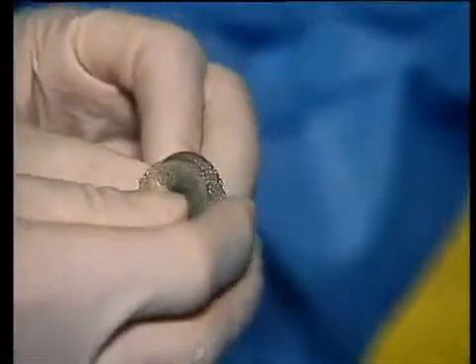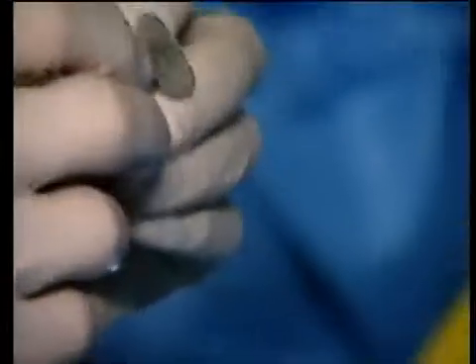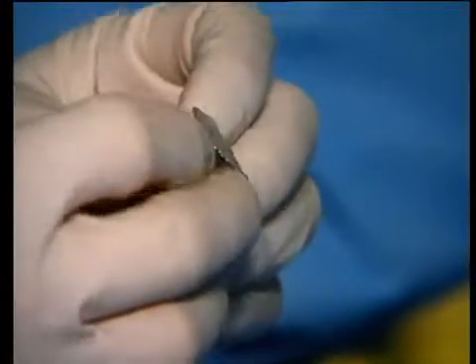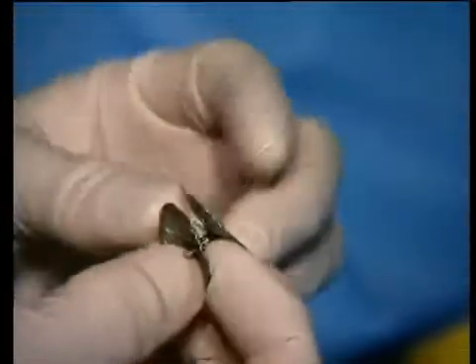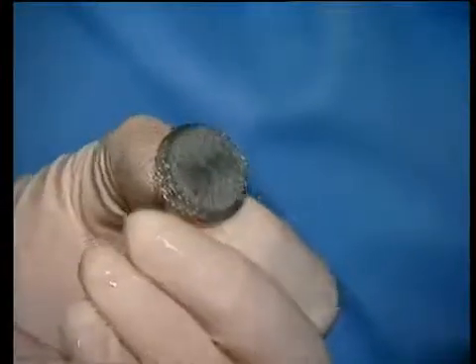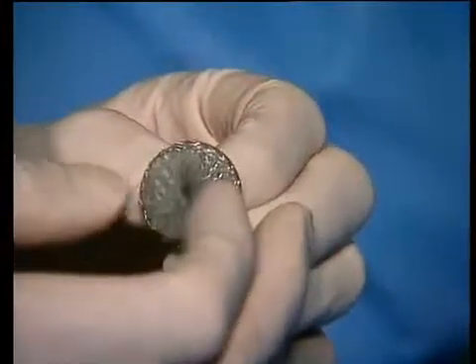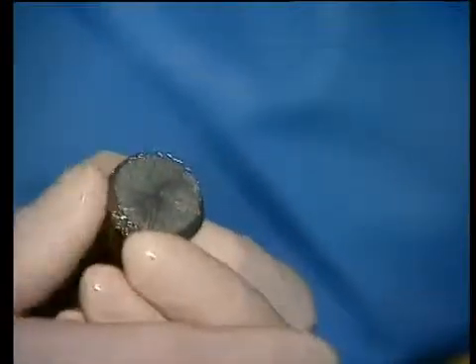The advantage over the Amplatzer is that it's just a single shell for the left atrium, which you can see here, which is a very flexible rim. Because it's not double-edged anymore, it adapts to the left atrial structure very nicely, and it doesn't have any hub on the left atrial side. That means we reduced the metal mesh to what is really important.